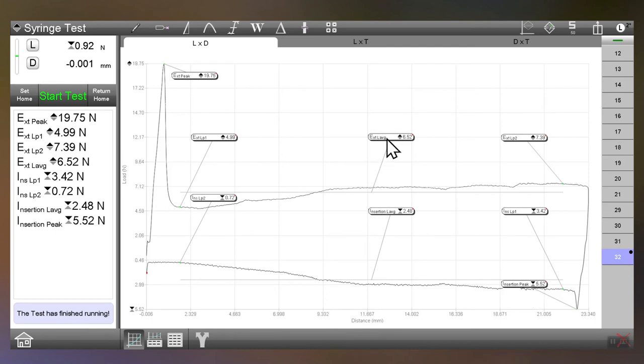Basically this is the extraction average. So I picked two points here. Did the average line as you can see going through.